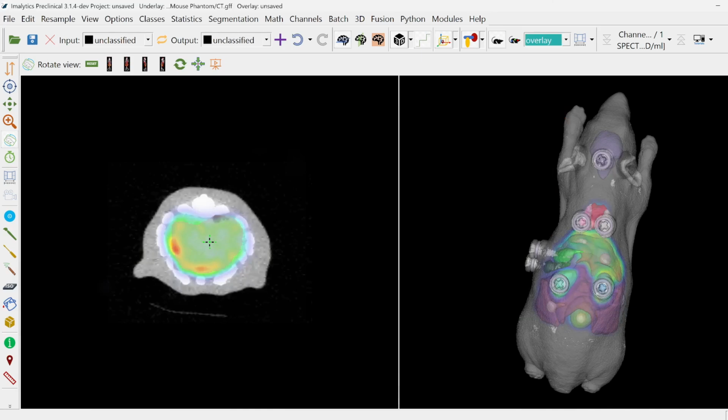And in some cases, the image quality of the CT might not be sufficient for fully automatic analysis. If this happens, or if you have any questions or encounter any issues with the workflow, feel free to consult the white paper or reach out to our team.